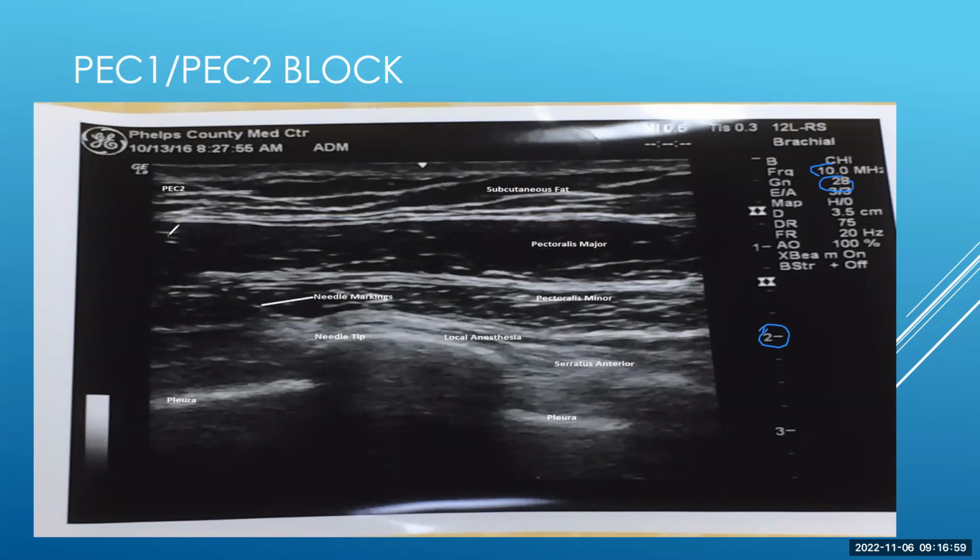Again, you can see the needle coming in here and these nice little markings. Remember in part 1 when I described that sometimes they put little notches on the needle that's going to reflect the ultrasound back to the ultrasound, and they come back hyperechoic. And this is exactly that. And that signifies that basically that's the tip of the needle. And that lets us know because you're going to see the ultrasound, if it transects the needle, like for example, right here, it's going to show up. You could be misled that that would in fact be the tip, but it's not.